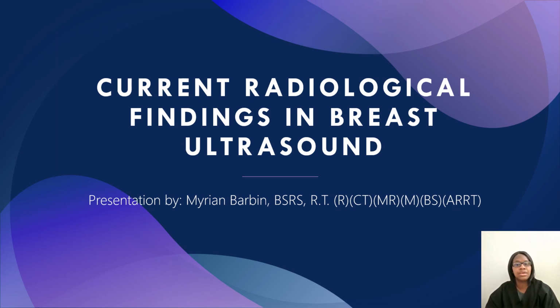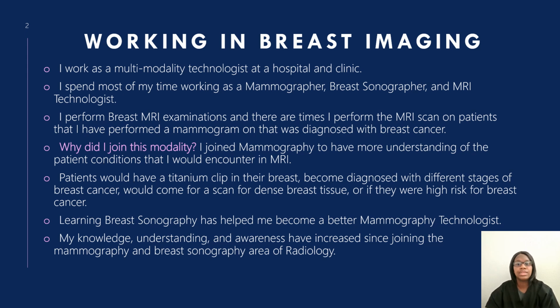In today's video, I am going to do a presentation on the current radiological findings in breast ultrasound. So I do work as a breast ultrasound tech. I work in radiology. I perform x-rays, CTs, MRIs, mammography, and now breast ultrasound scans.